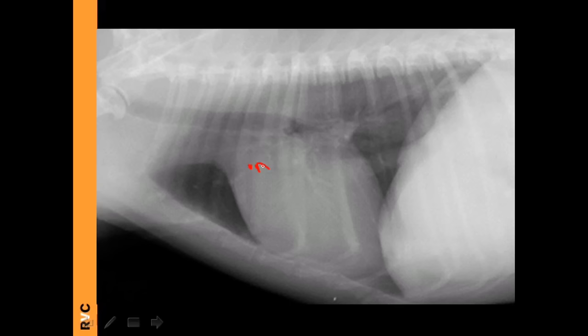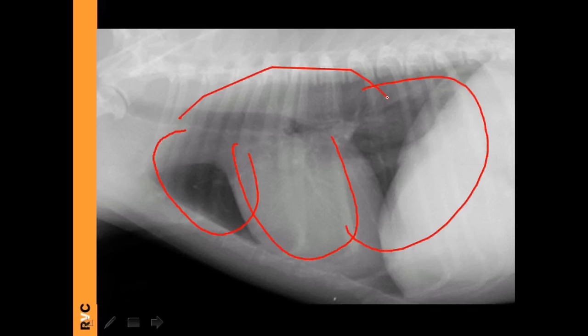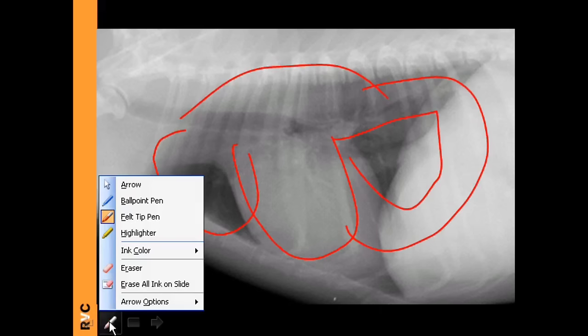We always have the triad — artery, bronchus, vein — everywhere in the lung. When evaluating the width of an artery or vein on the lateral view, we go to the proximal third of the fourth rib, and that width should be less than or equal to the proximal third of the fourth rib. The aorta is visible but not extremely clear. Remember that the caudal vena cava, cardiac silhouette, and aorta are mediastinal structures. Then we have the lung lobes: cranial, middle, caudal, and the accessory lung lobe.